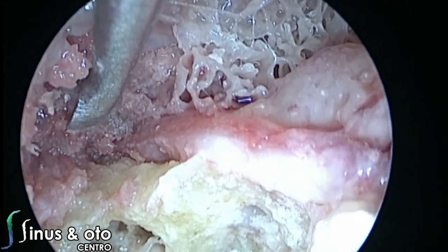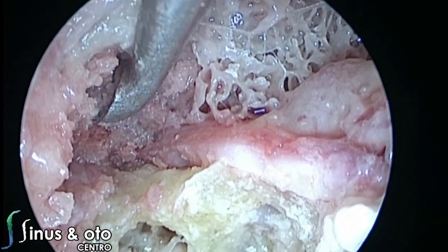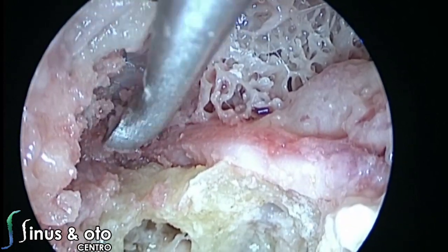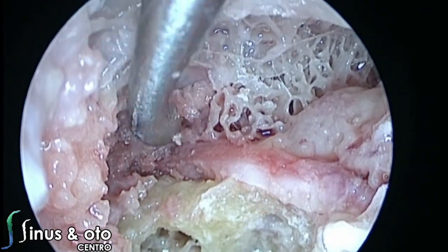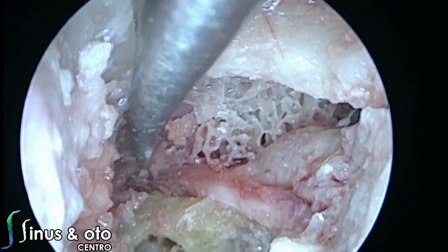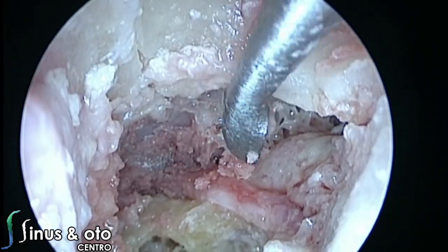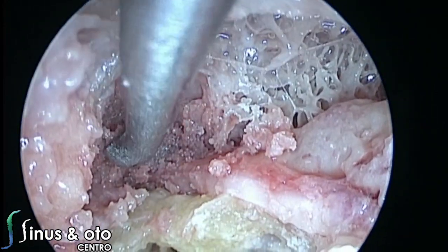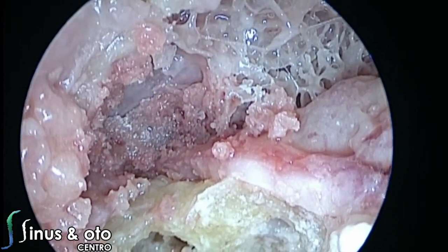And of course, if you have disease that pushes the dura towards the brain, you have space between the middle fossa dura and the geniculate ganglion, and then you can follow the disease, like a cholesteatoma, for instance. You can follow the disease endoscopically, of course, and you can remove it completely, avoiding other types of more invasive or more open approaches.